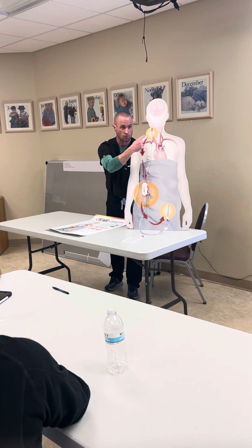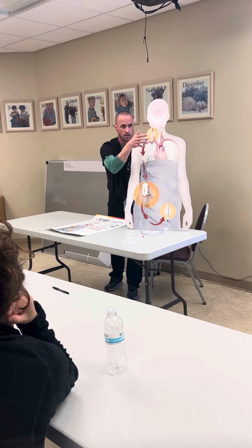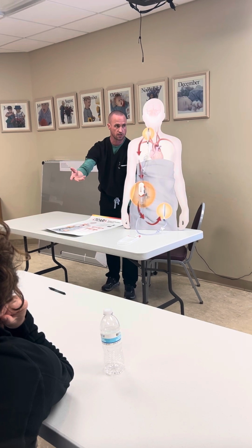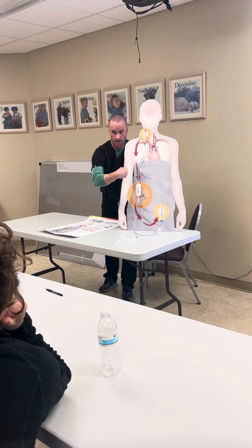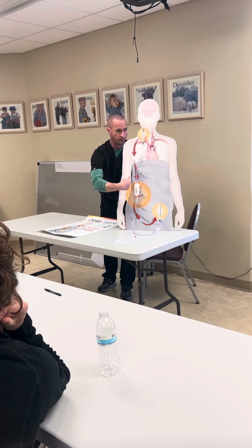So when we clamp the carotid, we're going to provide flow reversal because we have higher arterial pressures than venous pressures. And that's why we have anesthesia here, because we rely upon anesthesia to keep pressures in the 140s, 160s systolic. And that pressure provides flow reversal. So when we clamp this carotid, you'll see everything will flow backwards.